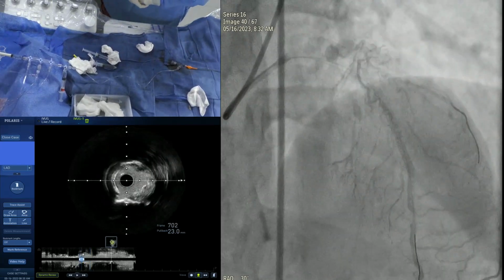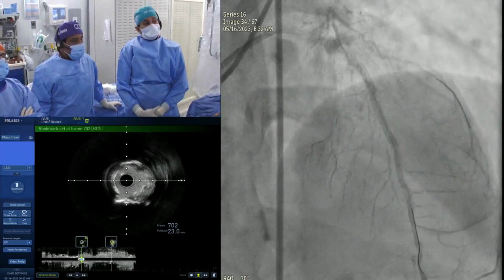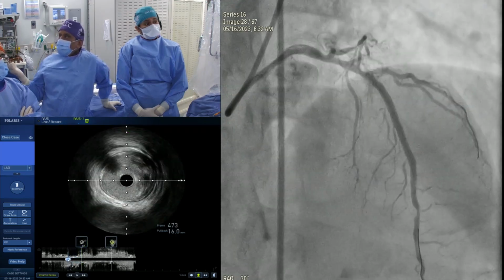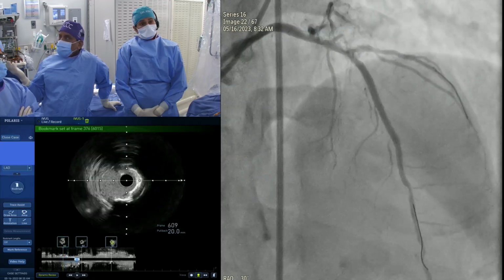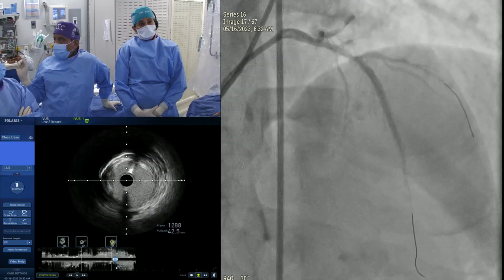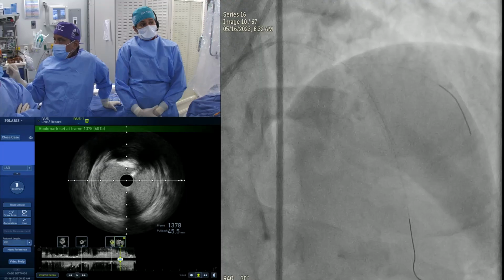Angiographically, what harm is it to bring the stent in the mid left main? Tell me. There's no harm. This patient may come back in 6 months otherwise, with progression of that moderate left main disease. And the circ was very small, not a big one anyway. I think we should just put a stent up to there. So let's go again, distal to the diagonal where we just did the balloon.